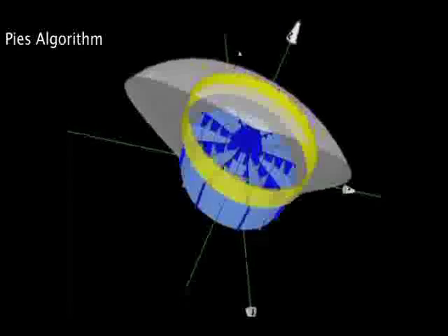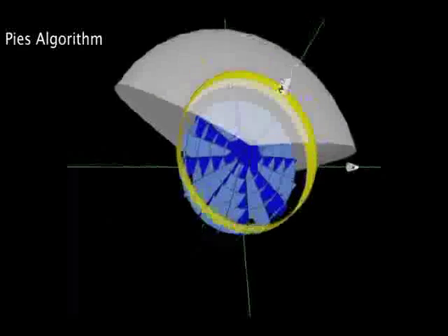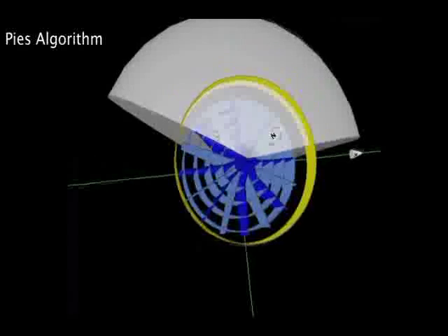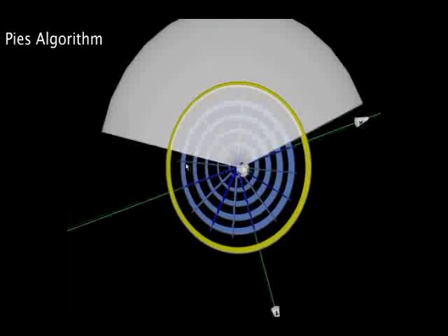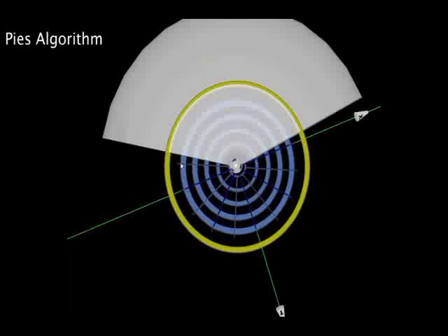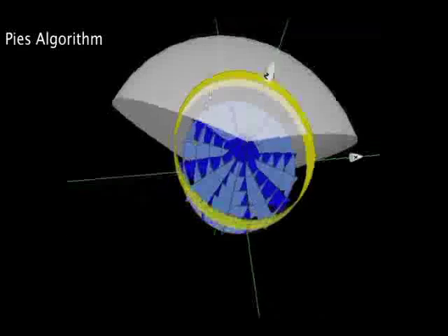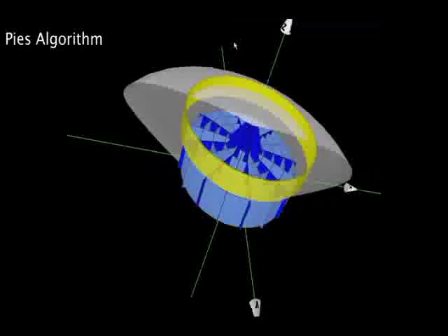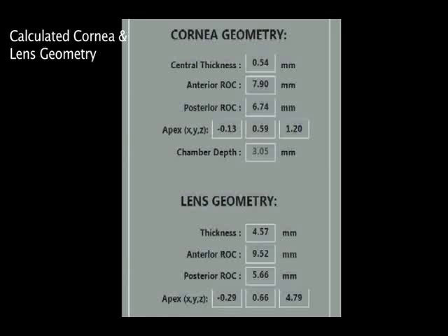The 3D reconstruction from the 3D CSI imaging and biometry system shows the placement of the capsulotomy in yellow and the fragmentation pattern in blue within the capsular bag. The placement takes into account the required safety clearances from the anterior and posterior capsule.